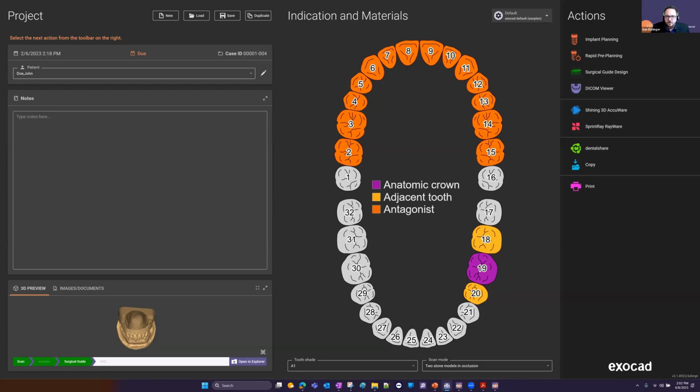So we never really milled any surgical guides. Typically they're 3D printed from what I've seen in my experience. But when it comes to post CAD, I would reach out to your distributors with the machines you have and see if they have materials. On the milling side, on top of whether the machine can handle the material you want to make it out of, is there a tool strategy already developed by that company that can produce the material you want?